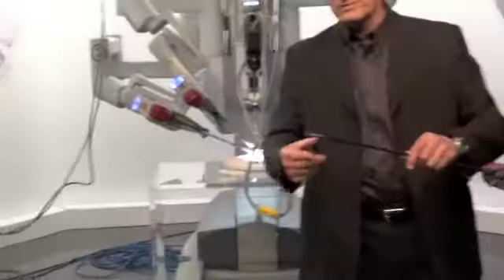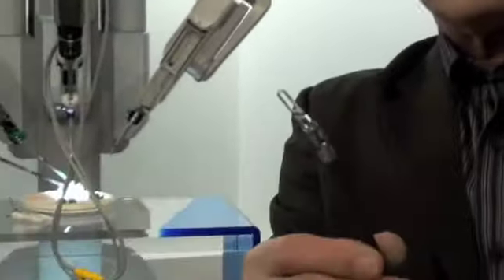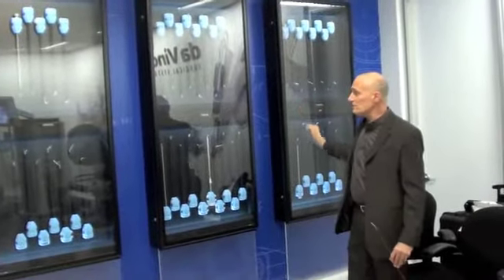Here is an example of an endo-wristed instrument. It opens and closes, it rotates and pivots, it goes in all directions, and you can see that this is smaller than the human hand and will do more than the human hand. This here is a grasper. What we have across this wall over here is all the various instruments that are adaptable to the DaVinci system.